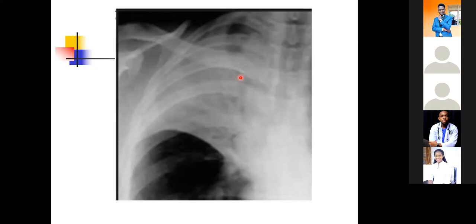We define contrast by simply saying that we are able to see two structures or two features as different because they appear different, or they have different degrees of opacities. Let me use that word.